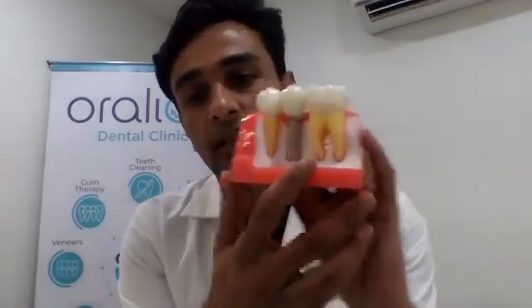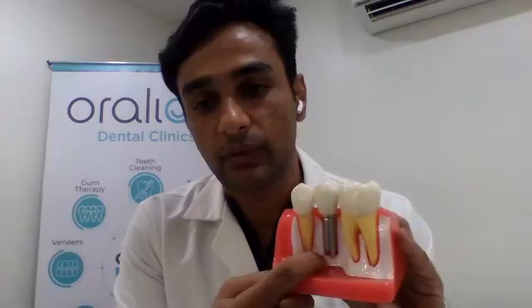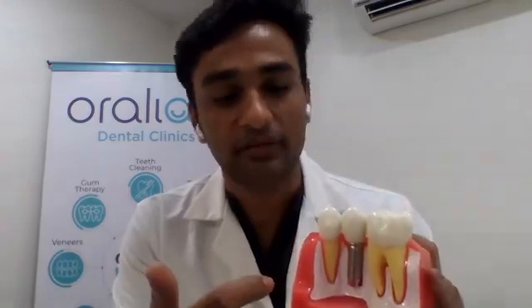Let me show you a model of what I have here in front of me. If this is the tooth, and imagine this is where you're getting a laser done. That's an implant, by the way, something that we've covered in our previous sessions. So that's the tooth, and here you have a periapical infection. After you do the root canal, you run the laser from the top till the bottom. The laser disinfects this entire area, so that any hidden bacteria, any hidden infection, all this gets cured.